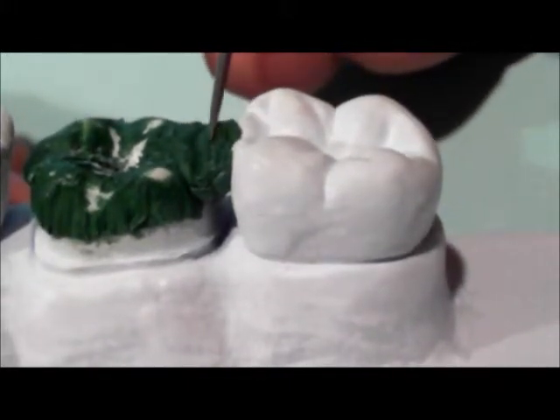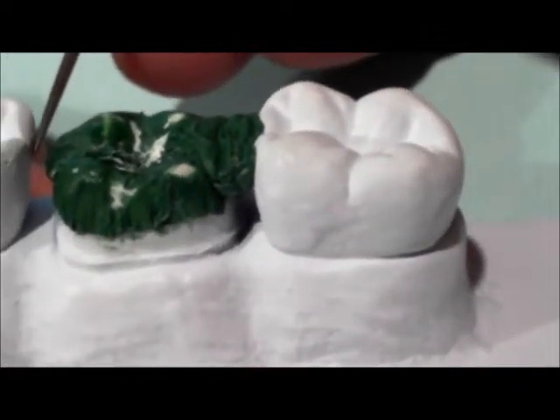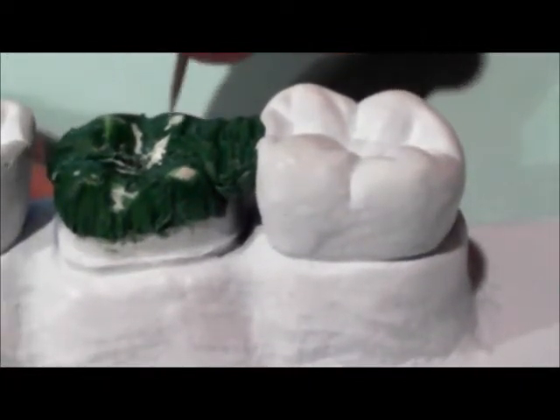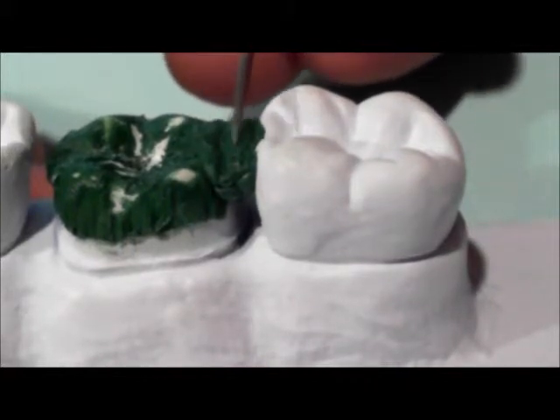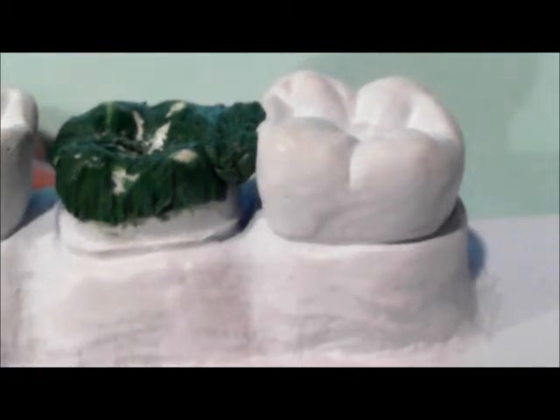Pack it in. And we're going to make another bar and put another one right here on the mesial side. We created the distal. We're going to make it nice and smooth. I'm going to show you what it should look like when it's done.